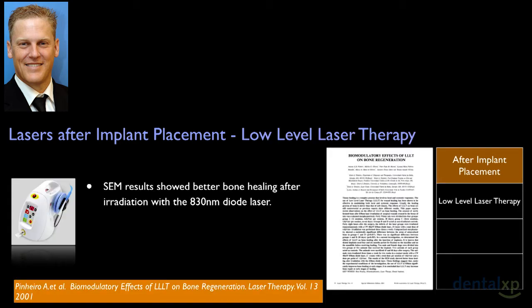This particular study showed that the SEMs of the diode laser could show that low-level laser therapy may increase bone repair at the early stages of healing. So how exciting for implant therapy.